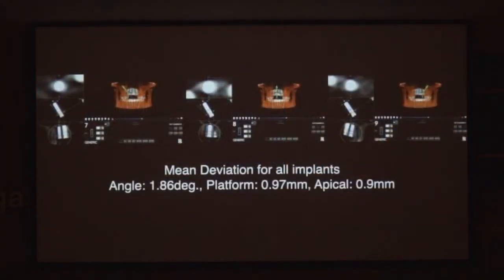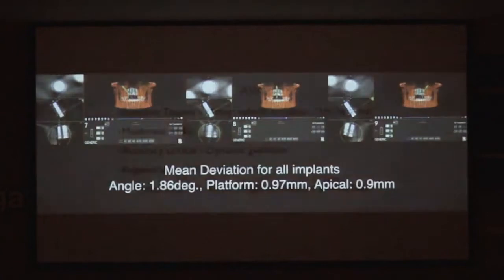Now, how'd I do? How accurate was I? I mean, it looked really nice restoratively, and that's really what matters, but I was under 2 degrees. This is the mean for all 3 of those. And look at those numbers. They're fantastic. And that's why it was so easy. So let's step it up a notch.